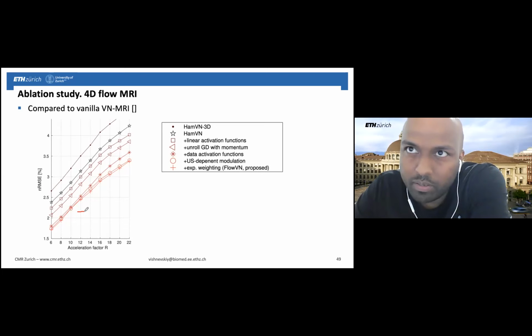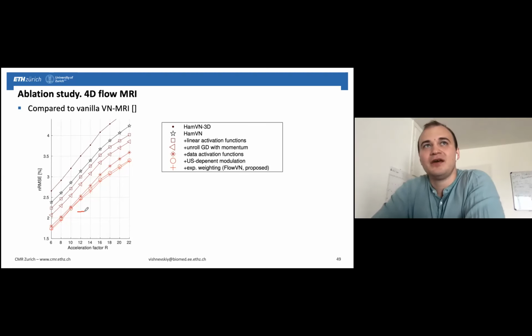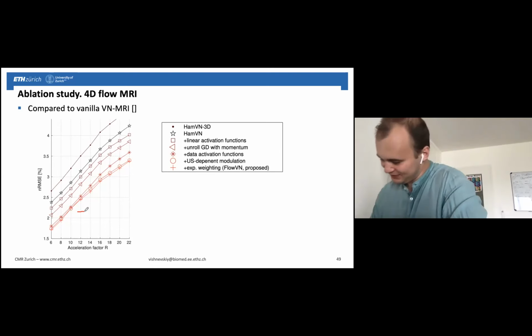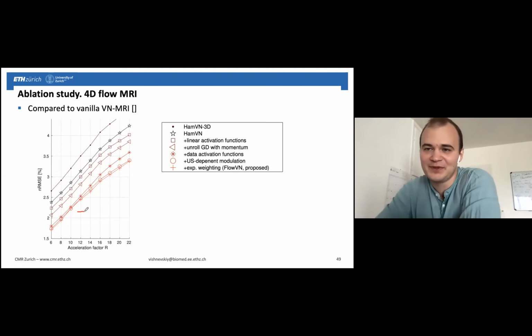Exactly. So how can one decide where to stop on the spectrum? Is it just based on empirical results, or can there be something better? Yeah, I think it's always like this. It's empirical. Here we added something like five different improvements to variational networks, and generally speaking, for unrolled gradient descent iterations, I cannot think of anything more.